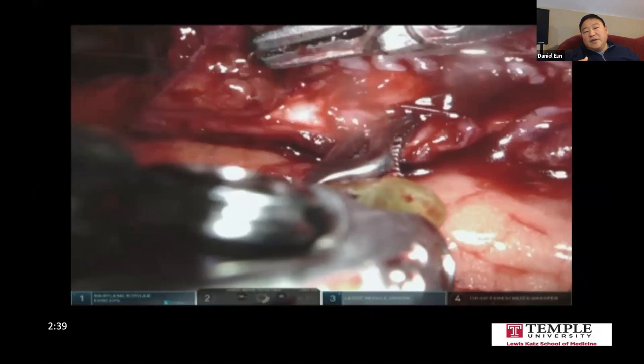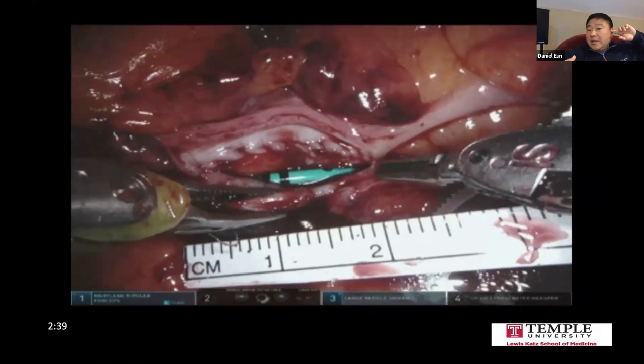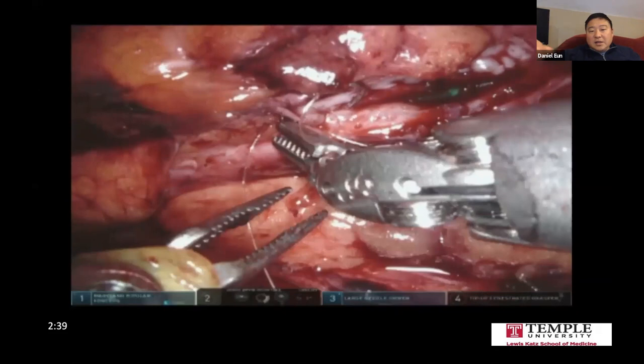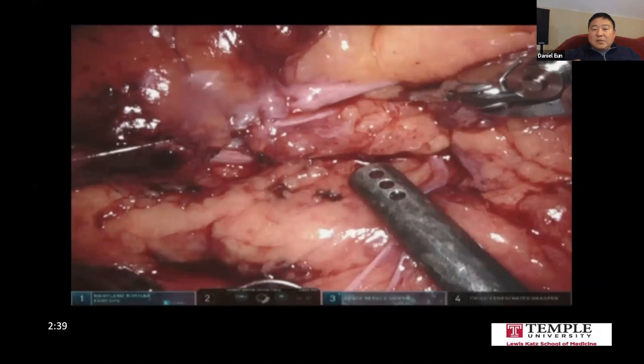What I'll say about this is that one of the most critical decisions when you do an appendix interposition or an onlay like this is that you really need to position the cecum properly for you. A lot of times we'll do a cecopexy just to hold the cecum in place favorably and not have it shift around before or after the surgery. If you lay it in a good spot where it's favorable, then it won't continue to fall in your face, and it allows you to technically put this back together again with greater ease.